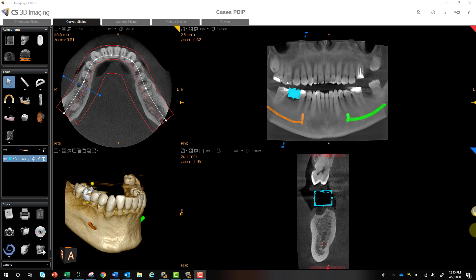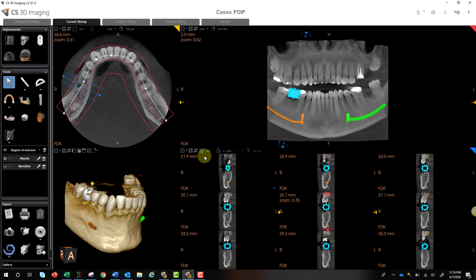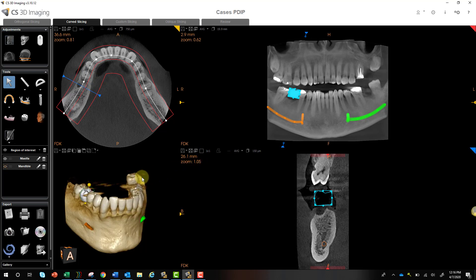Hey, this is Phil, and this is part four of the Implant Planning Tutorial. In parts one through three, we've done all the initial setup: creating our panoramic curve, mapping our nerves, playing around with different regions of interest tools such as deleting the maxilla or mandible easily and toggling those back and forth, and different cross-sectional tools. If you haven't watched parts one through three, go ahead and search those to get up to speed.